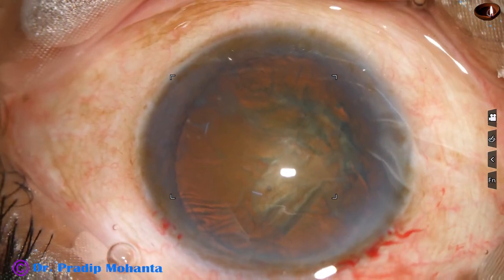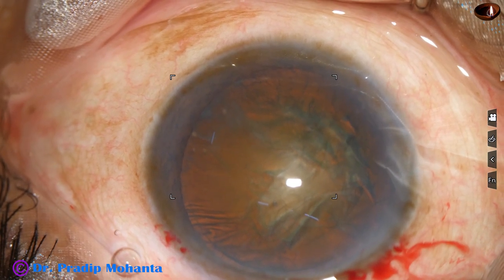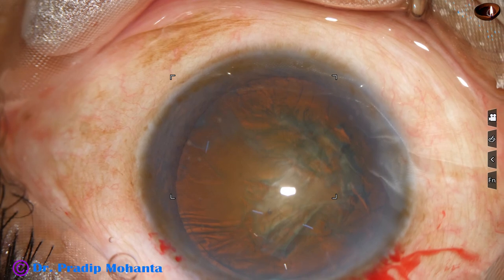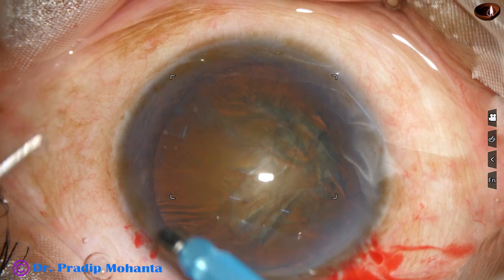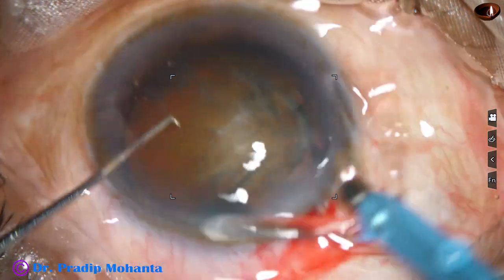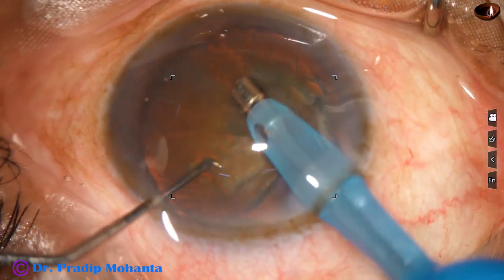Now is the time to introduce the phaco needle into the anterior chamber. The machine being used is from Alcon. The tip goes bevel down into the anterior chamber.